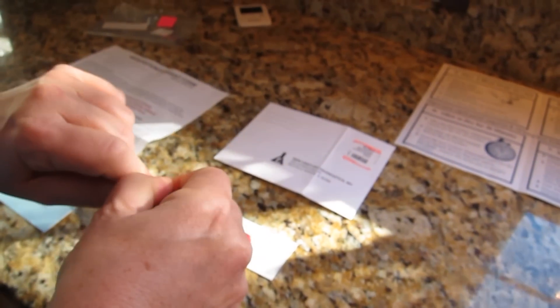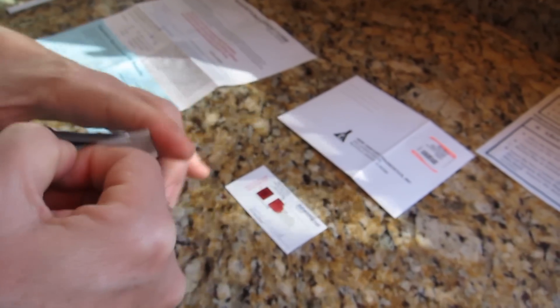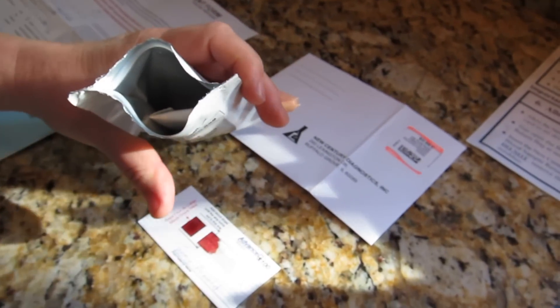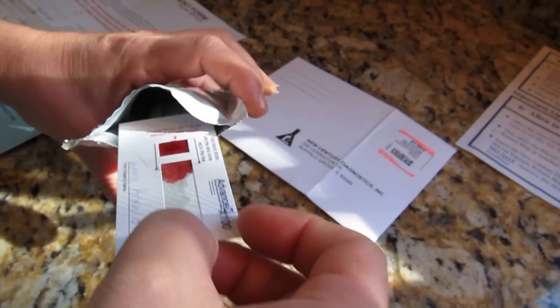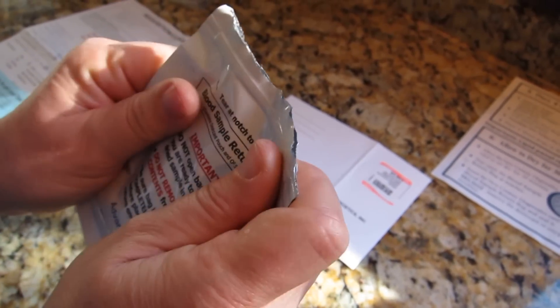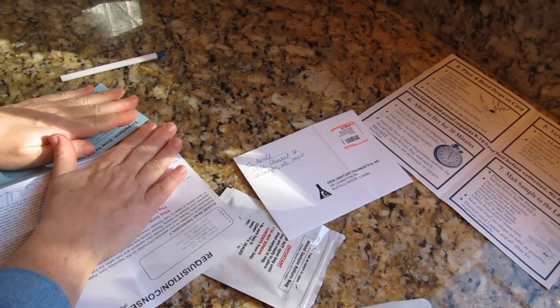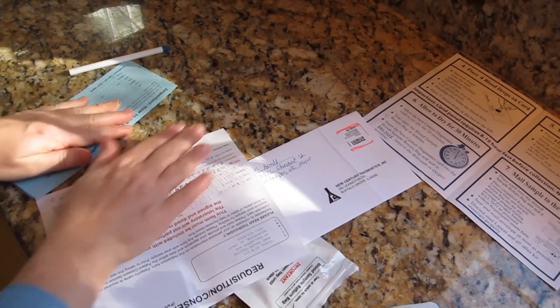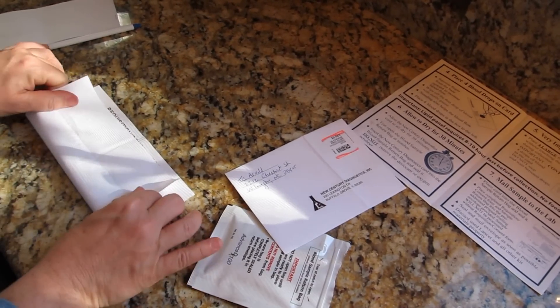Tear open the blood sample return bag at the notches and do not remove the desiccant that's inside the bag. Insert your Advanced DX card into the blood sample return bag and seal it. Tear off the top of the consent form and place it and your sample return bag into the pre-addressed prepaid mailing envelope that's provided.